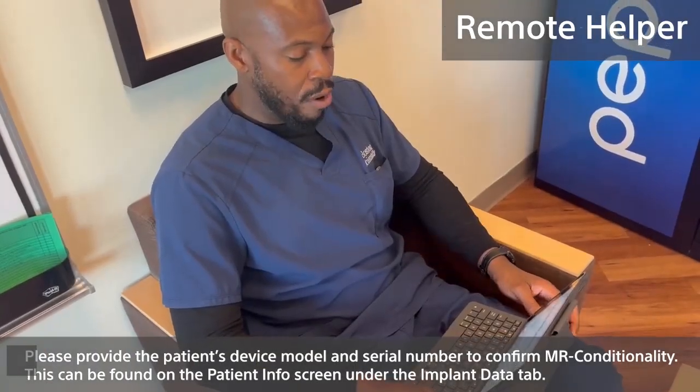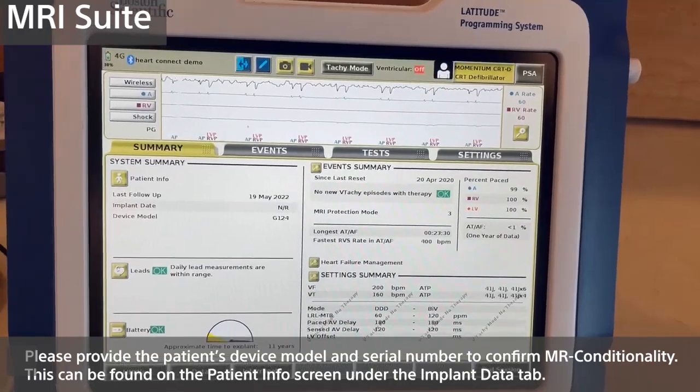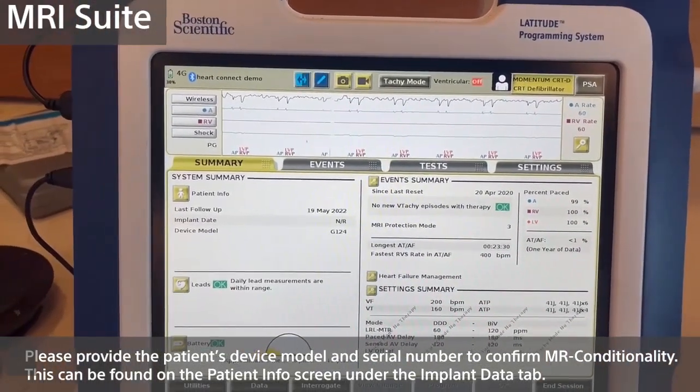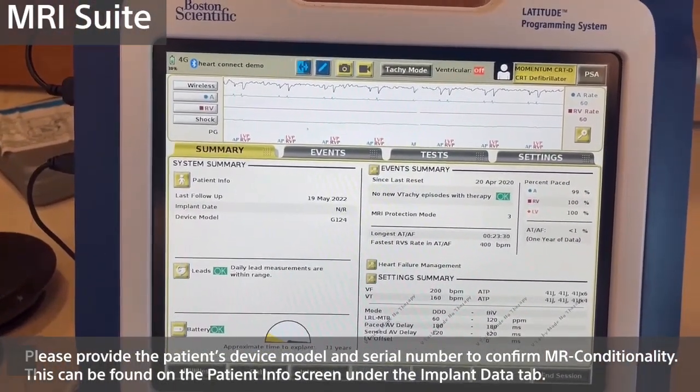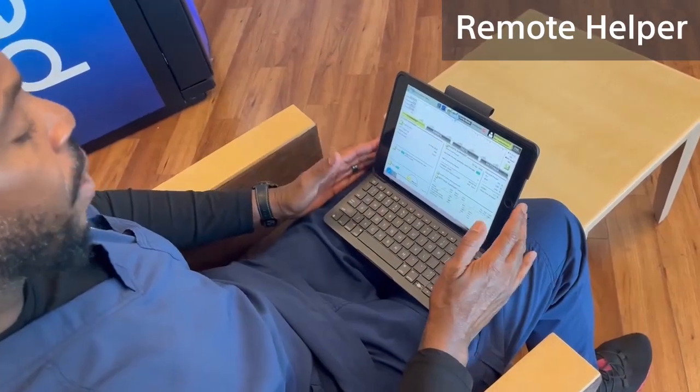Do you have the physician order form available right now? I do. The physician would like the device programmed at a mode of DOO — D as in David, O, O — at a rate of 70 beats per minute. Okay, perfect. Let's get started.